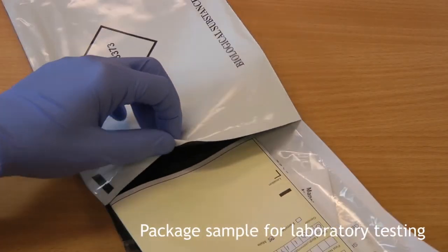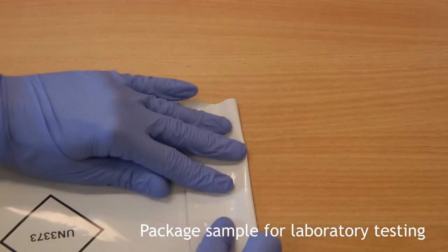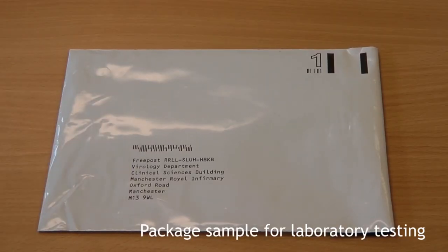Finally, put the completed request form and bag containing your sample into the grey FreePost envelope, seal it and post it. Our turnaround time is one week from when we receive the sample.